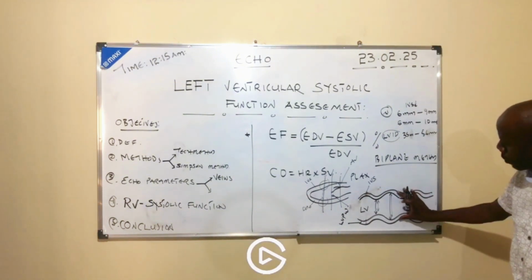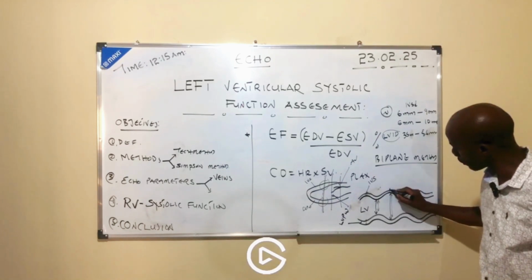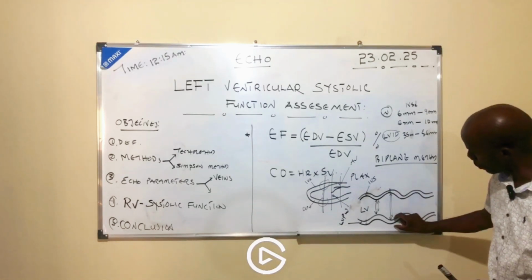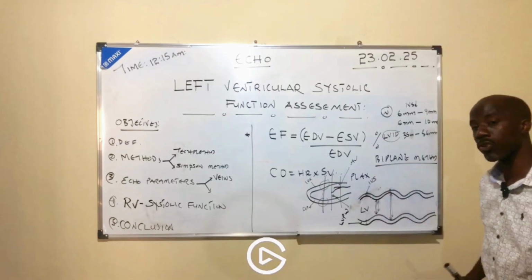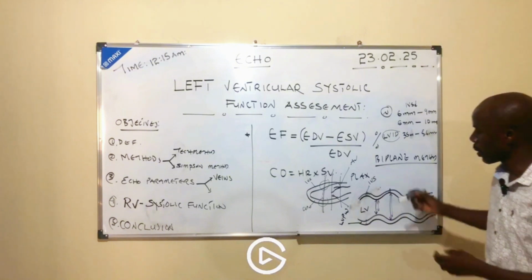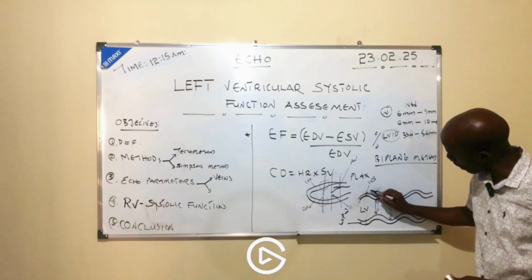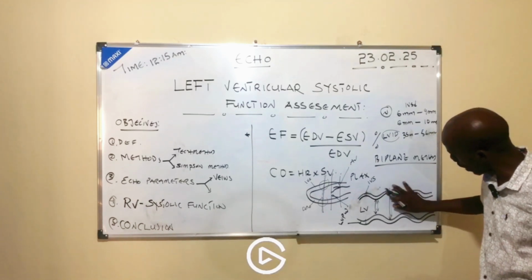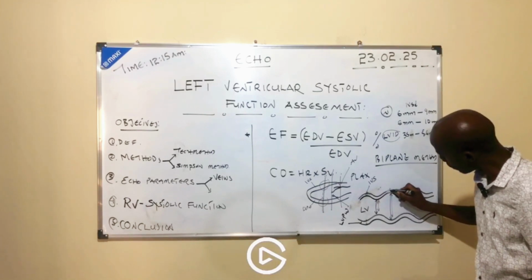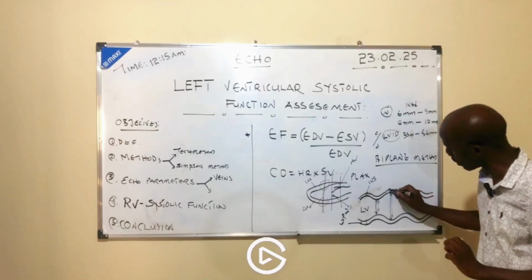After you do your calculation, that is, you measure your left ventricle internal diameter and the posterior wall and the thickness, the machine is going to automatically calculate your ejection fraction. So this is how you start. You start with your intraventricular septum in diastole. You measure and make sure your measurement is very accurate. You measure from there to there. This is the thickness in diastole.